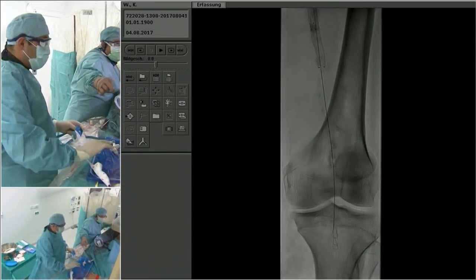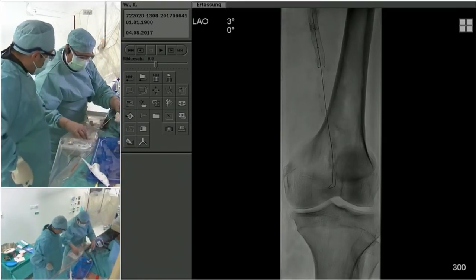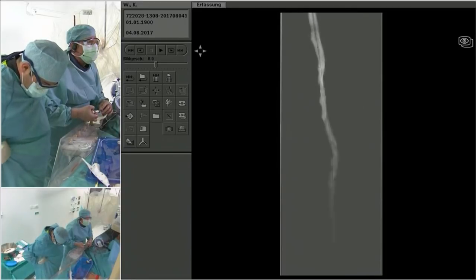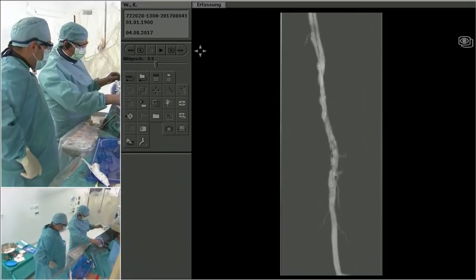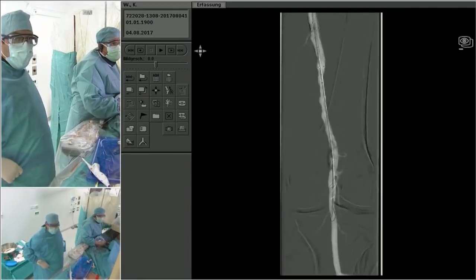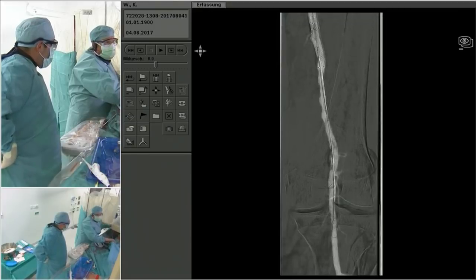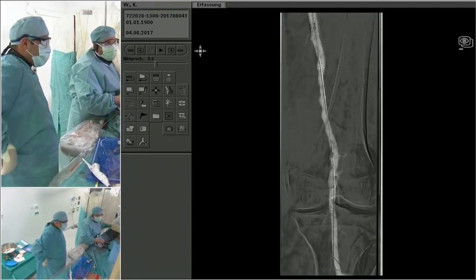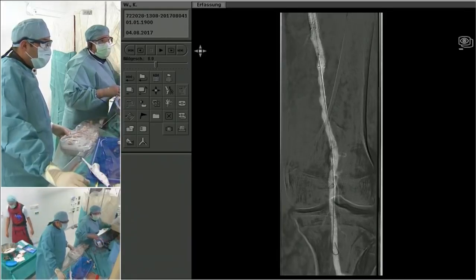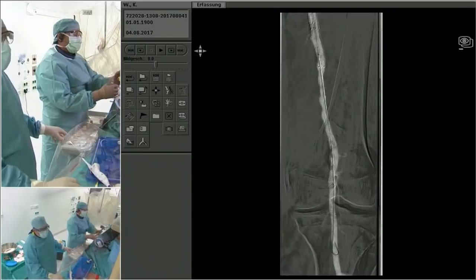They used a drug-coated stent at the distal edge of it. How many of you would have gone with a Supera here? Yeah, if you're asking me, I would have probably done DCB and Supera, because I think that's now getting into the P1 segments and that area. So I would have most likely done DCB with Supera. But I don't know. John, do you agree? Or you would have left it alone? I agree.